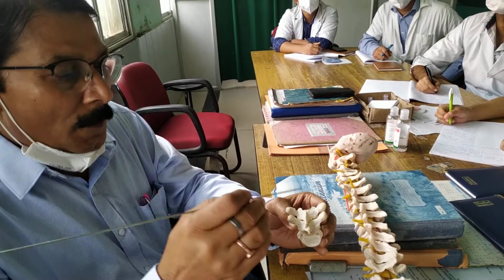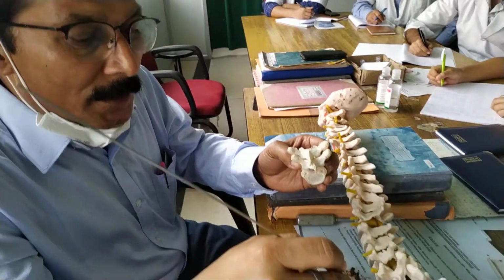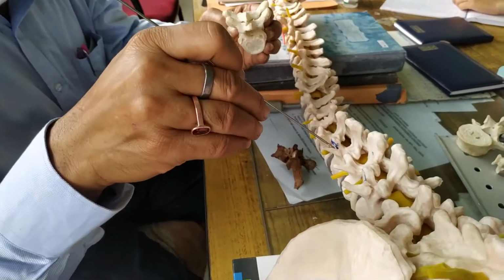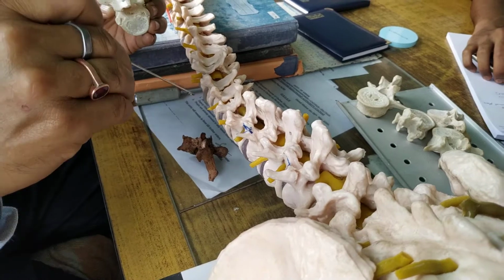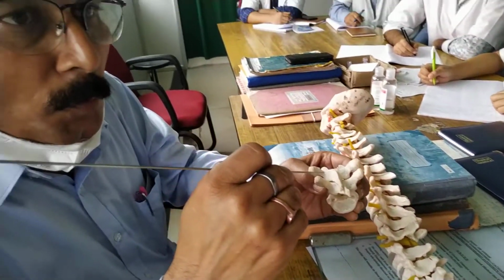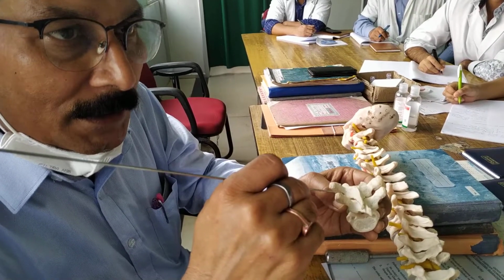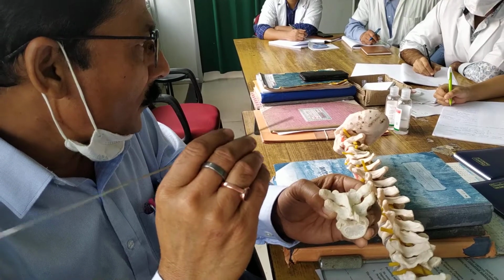Then what next? Next, there are two things you have to find out. As in the case of your lumbar area, as I said, the transverse process is important. Another point is the facet joint is important. Here also the same is true, that one needs to find out the two bony landmarks. One is your transverse process, another is your facet joint. Yes, madam? Is it clear?